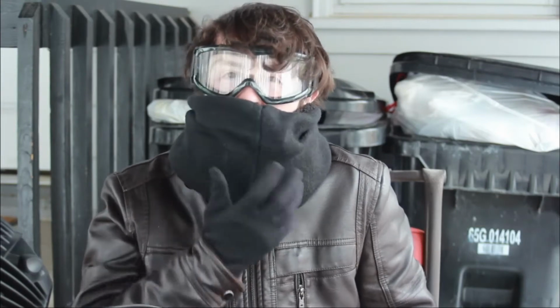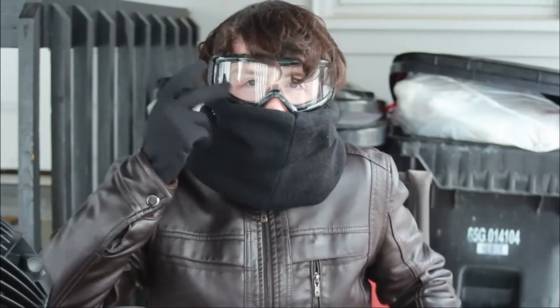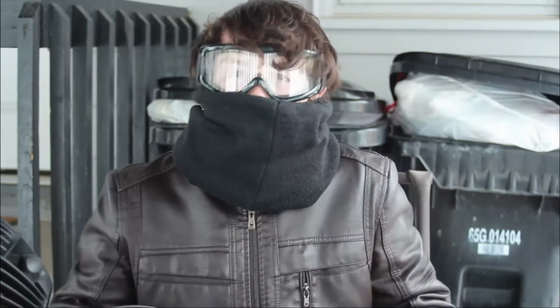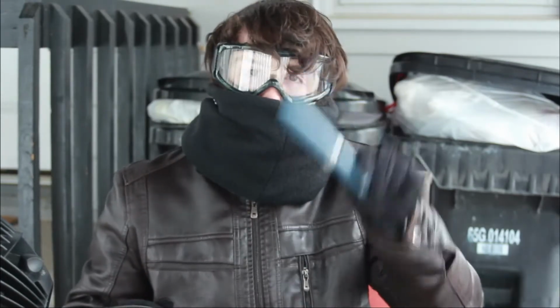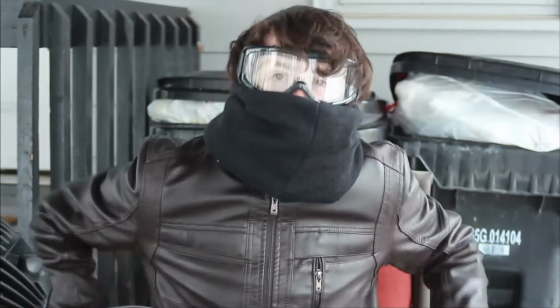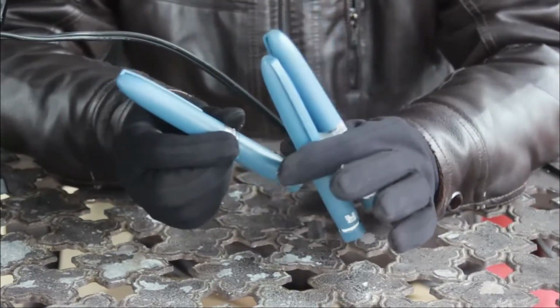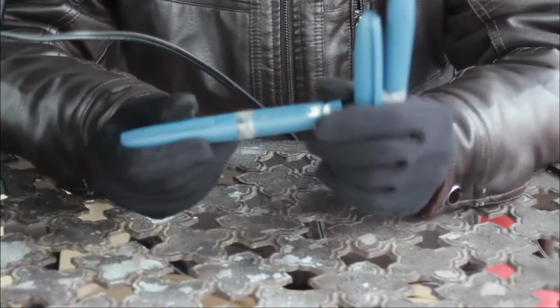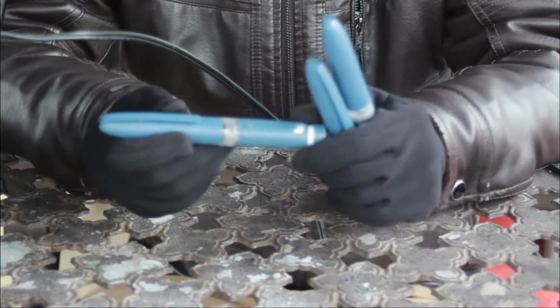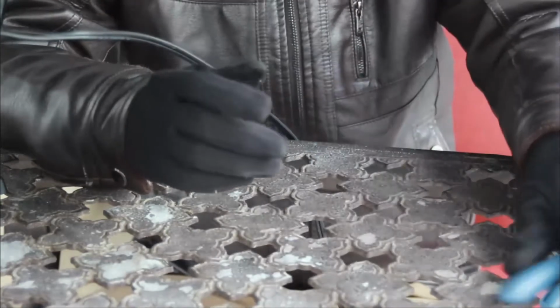We got a little scarf here, a little gaiter to protect my mouth from any fumes, and we also got some safety goggles. Now, as beautiful an image this is, I think it's time we actually zoom in on the pen itself so you can see my hands at work, okay? So here we have 3 different Lily Humalog Junior pens, and by the way, the Humalog Junior pens that Megan provided me, these actually do half units, meaning that when a syringe is in here, they're going to do 1/20th of a unit, and that's going to be pretty cool.